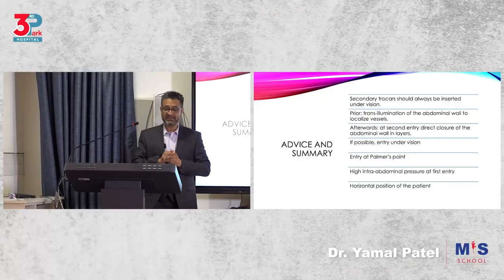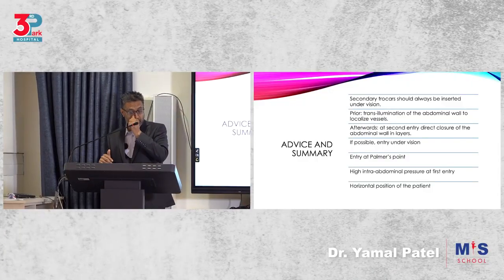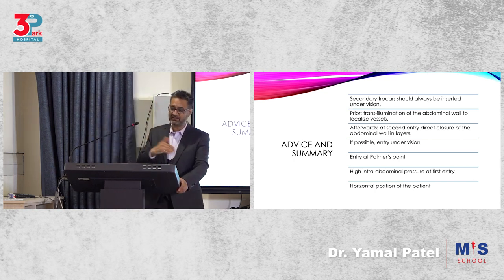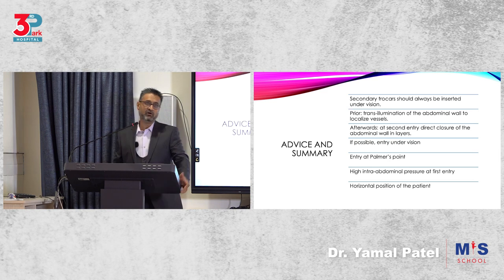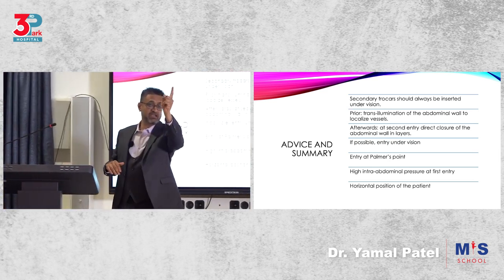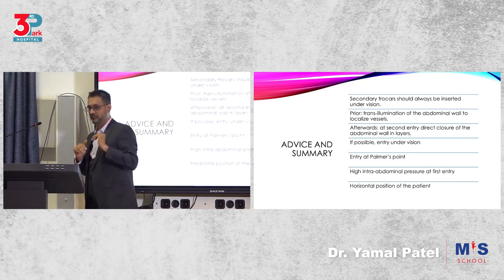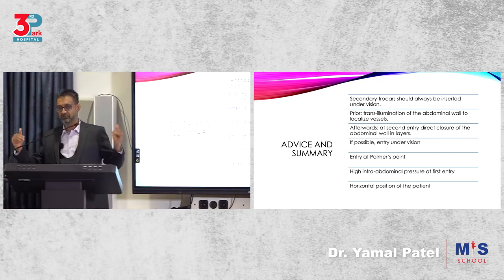Another piece of advice, a summary of what is important. Secondary trocars: the primary is going to be a blind entry. Secondary are always under vision, and you always keep the inferior epigastric under view when you're putting in those. You don't want to hit that inferior epigastric. Always try and stay away from them.